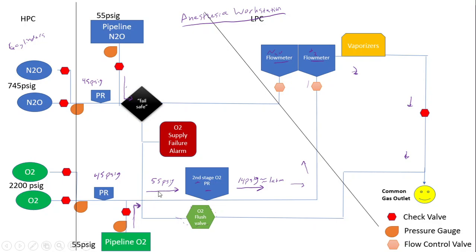At the same time, we need ways to detect decreased oxygen concentrations, and if we do that, then we can shut off all other gases to be delivered to our patient to avoid our patient from becoming hypoxic. We have to have a way to continue to decrease that pressure to be friendly to the lungs, and once we do that, then we can regulate how much of that gas we can administer through our flow meters and through our flow control valves.